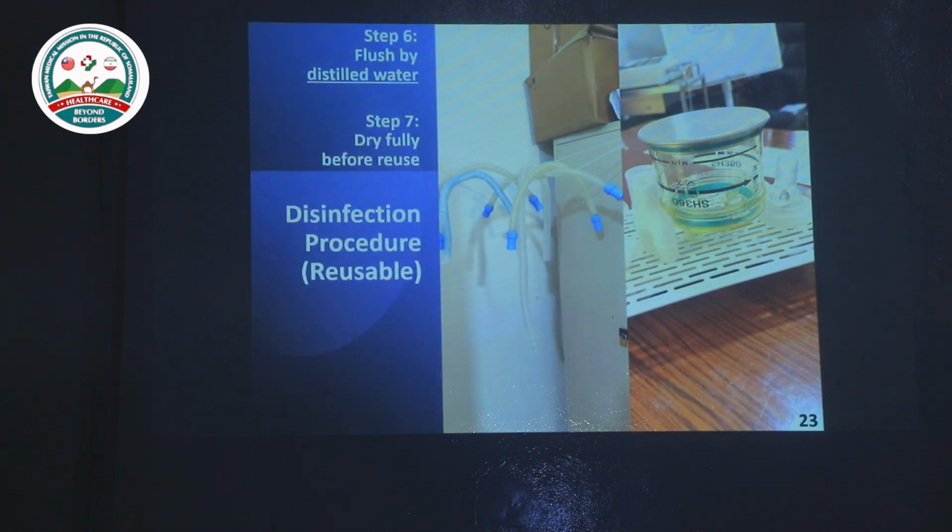And after that, this is one of the important parts: after disinfection, we need to use distilled water to clean, because if we use tap water again, the tap water still has some bacteria inside. So if we use tap water, this can also contaminate our cleaned or disinfected circuit. So we need to use distilled water after disinfection. And after that, just dry before reuse.